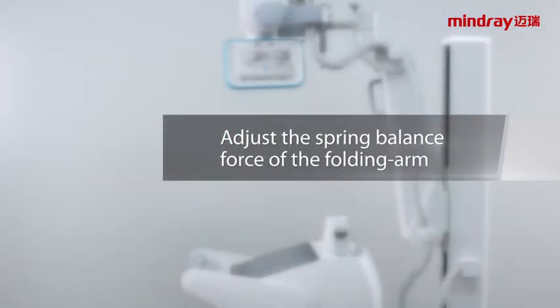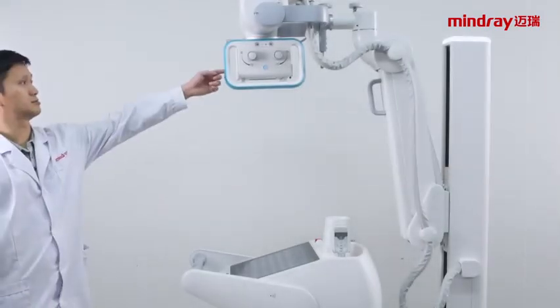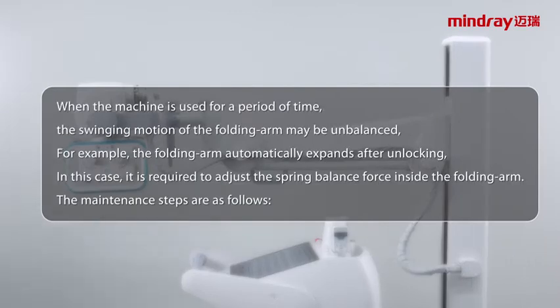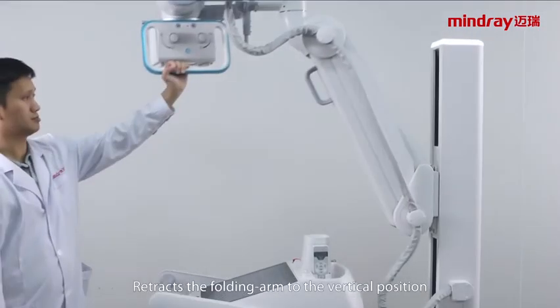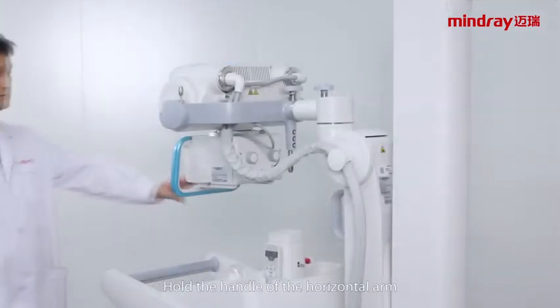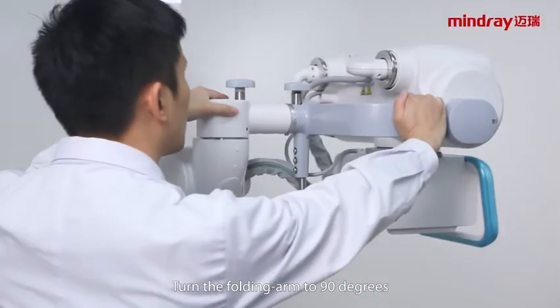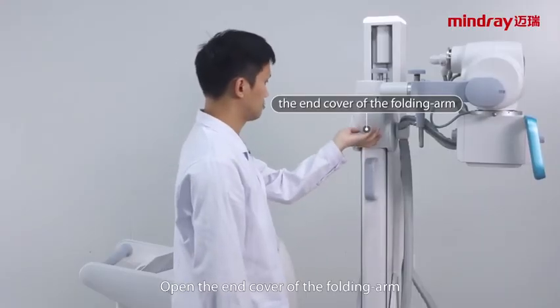Adjusting the spring balance force of the folding arm. When a machine is used for a period of time, the swinging motion of the folding arm may become unbalanced — for example, the folding arm automatically expands after unlocking. In this case, it is required to adjust the spring balance force inside the folding arm. The maintenance steps are as follows: retract the folding arm to the vertical position, hold the handle of the horizontal arm, turn the swing arm aside, turn the folding arm to 90 degrees, and open the end cover of the folding arm.